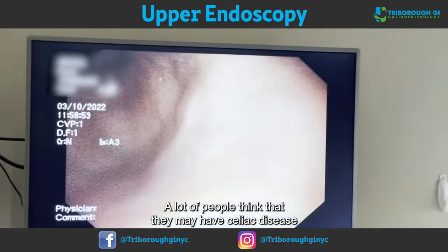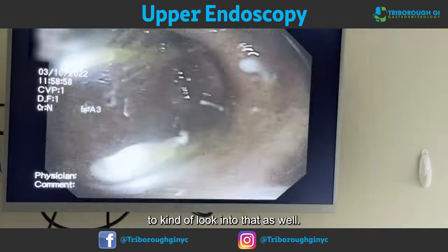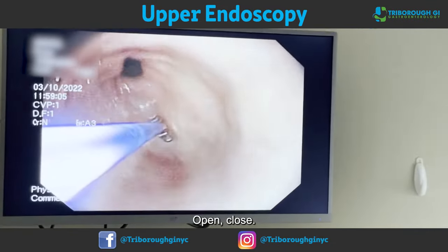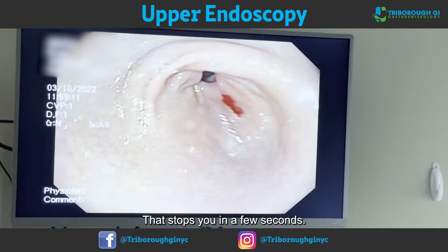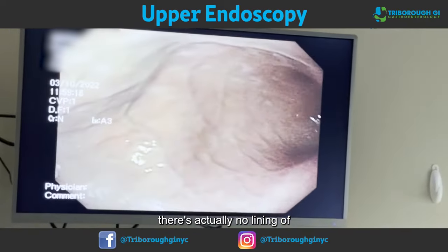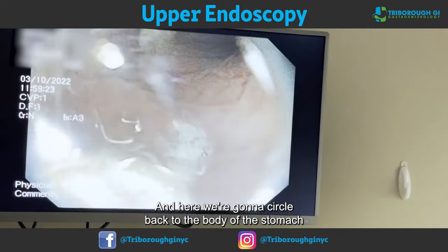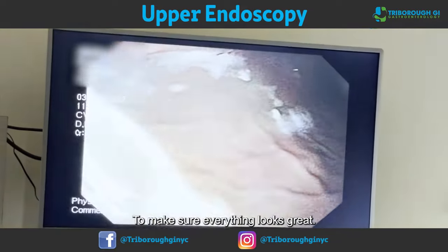A lot of people think they may have celiac disease or some sort of gluten sensitivity, so this is a very good way to look into that. Now we're back in the stomach and we're going to take some samples here — open, close. You might see there's a little bit of bleeding; that's totally normal, it stops within a few seconds. These biopsies are not deep and they do not hurt. There are no pain receptors in the stomach, so there's no pain related to these biopsies.